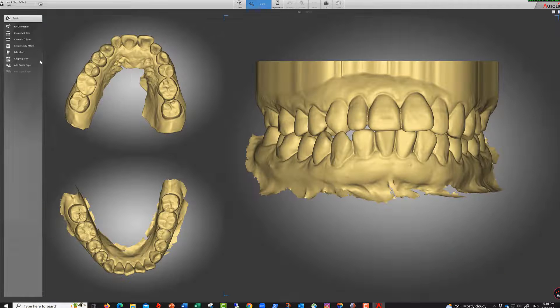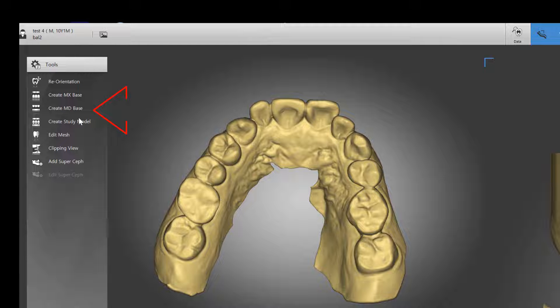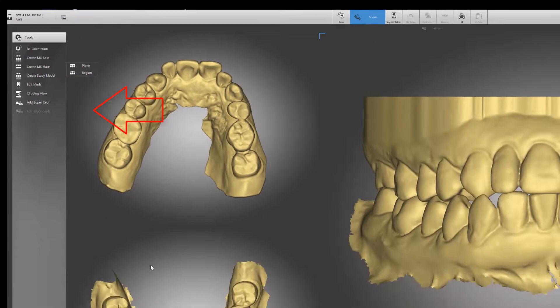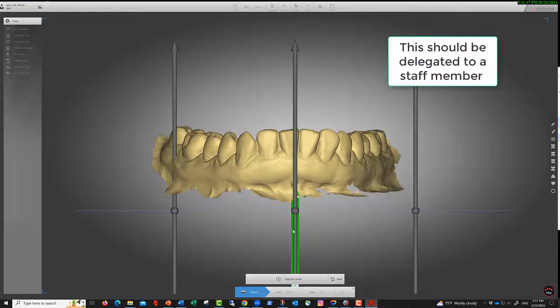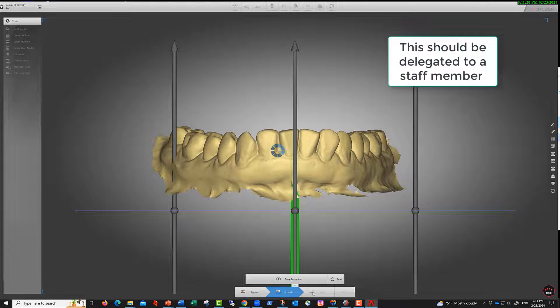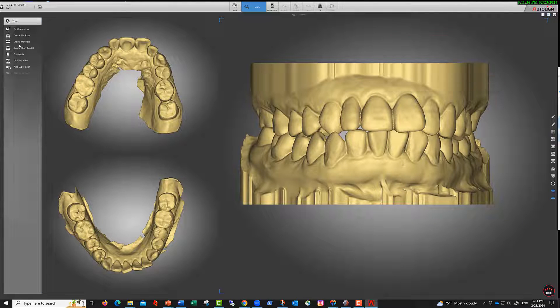Then create the mandibular base here. Again, you can decide to make the base a little bigger. Once you like what you see, you separate the two.